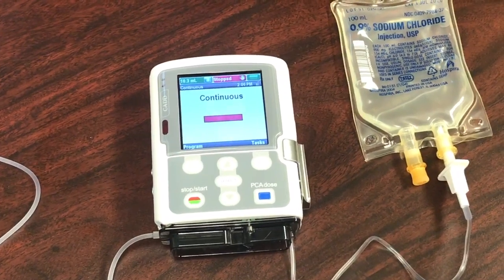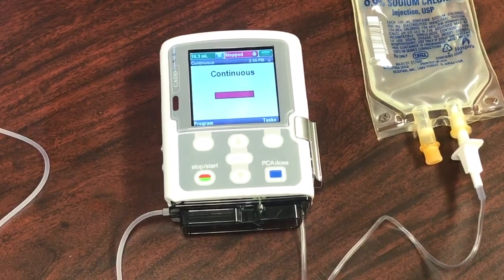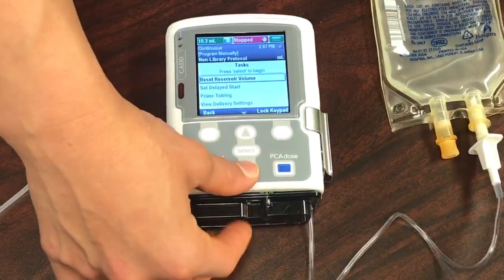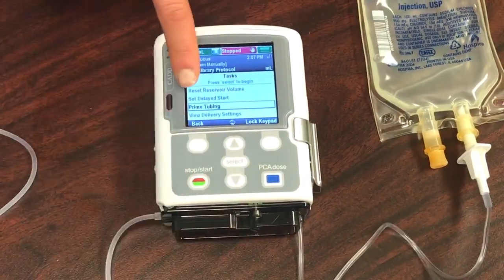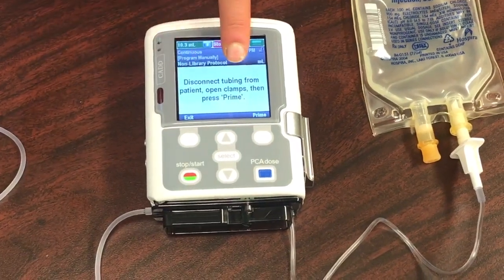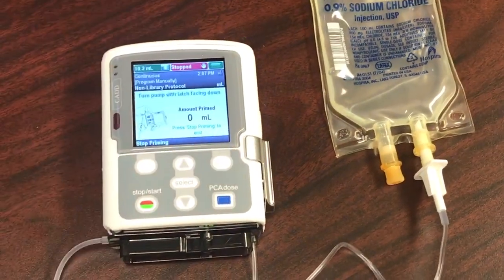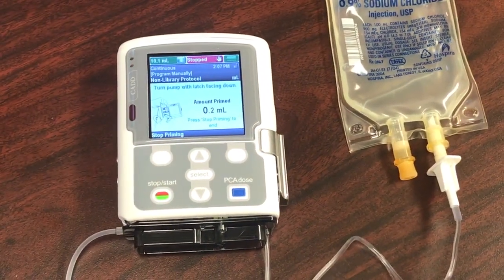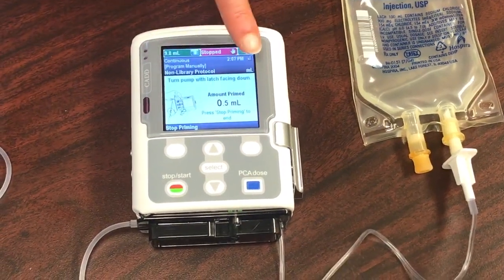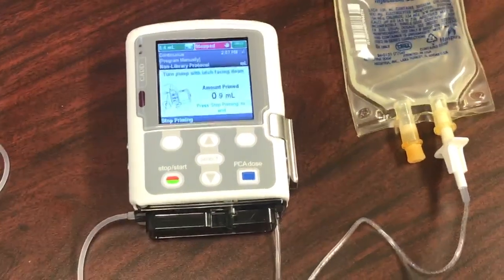After you've powered your pump on, the next step is priming the tubing. To prime your tubing, go to the Tasks button, then using the keypad scroll down to where it says 'Prime Tubing' and click Select. Making sure that the tubing is disconnected from your patient, go ahead and press Prime. The pump automatically primes your tubing — the main thing here is looking for dripping at the end of your tubing.